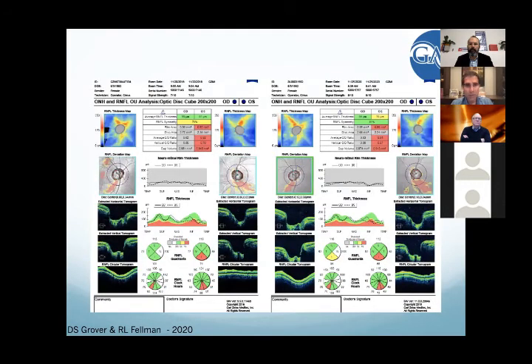And you see on the left side of the screen from November 2018, and on the right from November of 2020. So 2 years difference, 2 years and 5 days. You could possibly say that you see the 81 average thickness on the left in 2018 and it goes to 78. I think that I'm going to chalk that off to just normal test variability. I don't think that's a significant change.